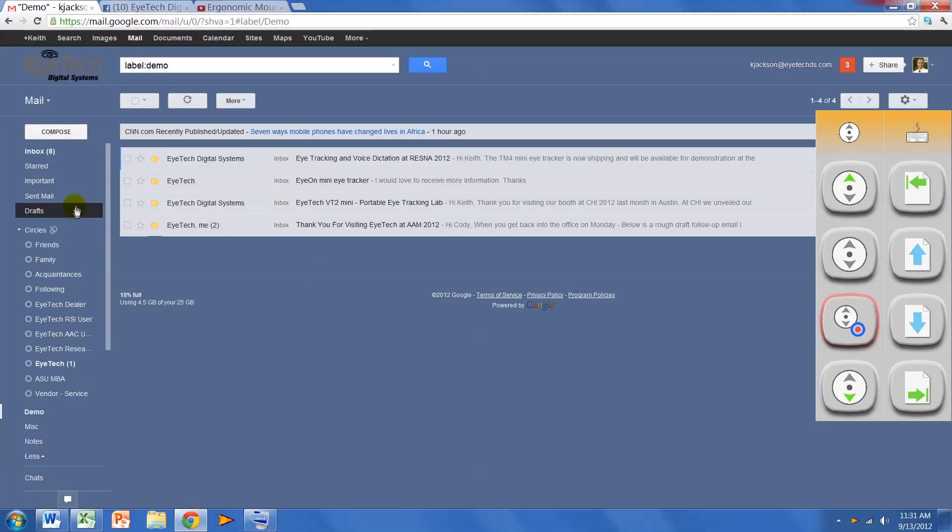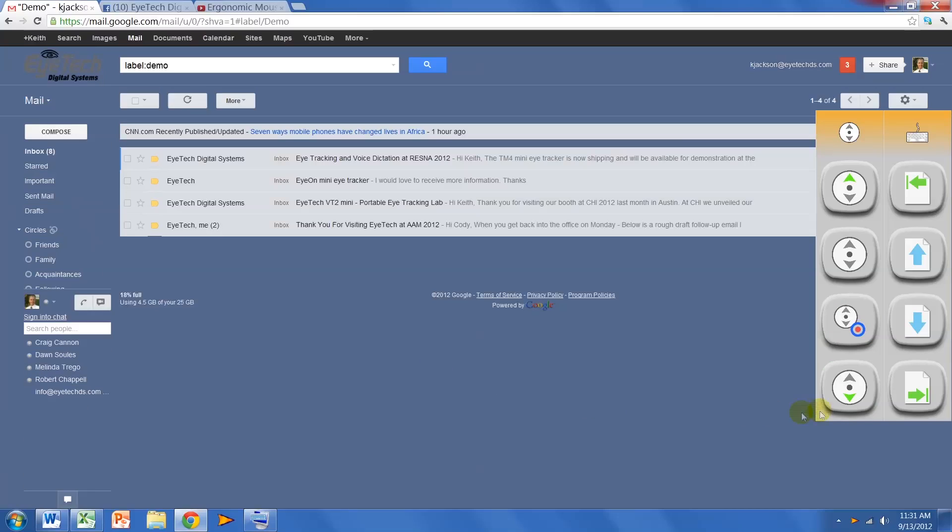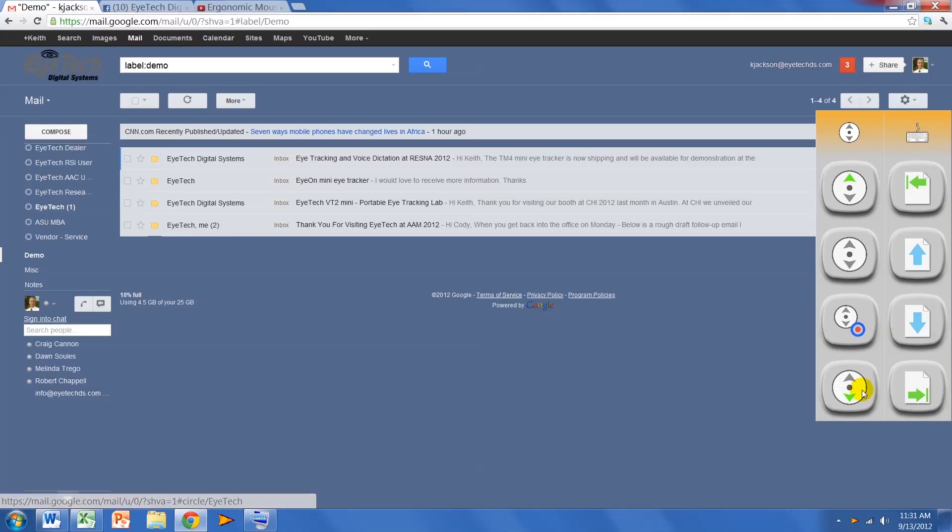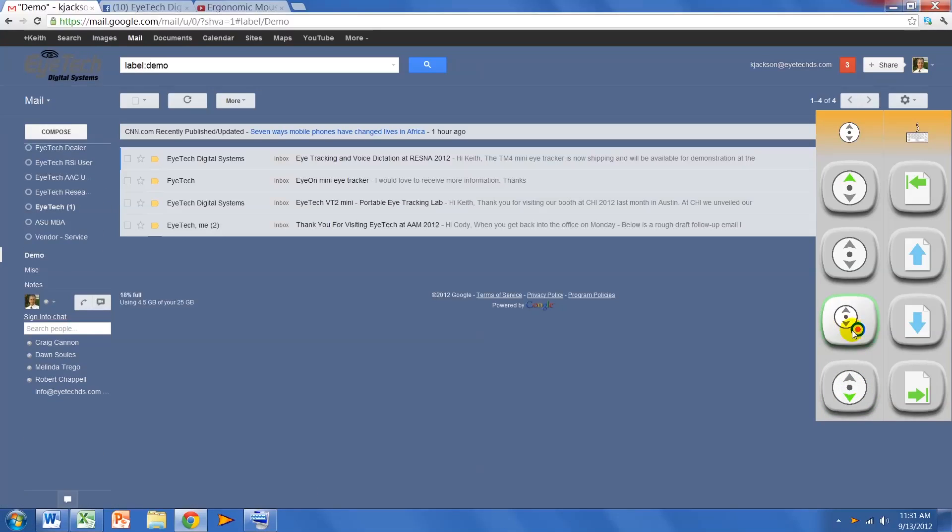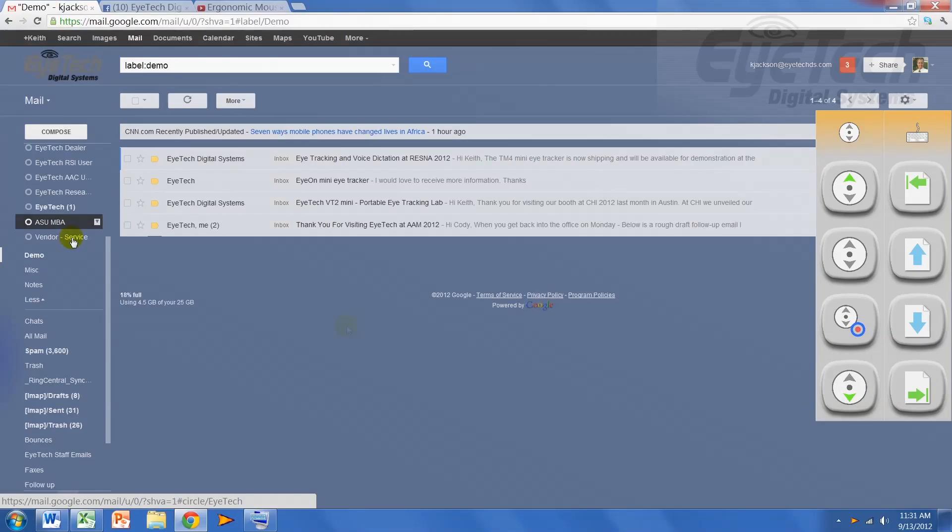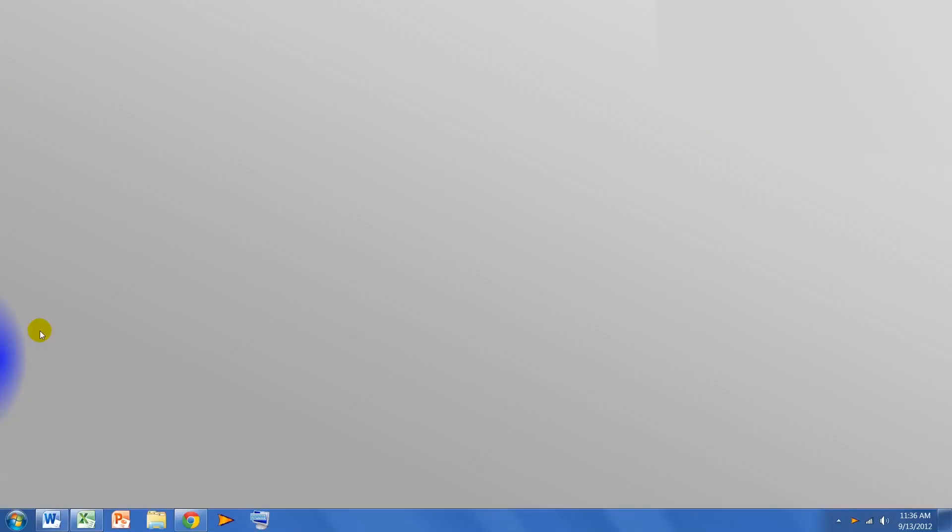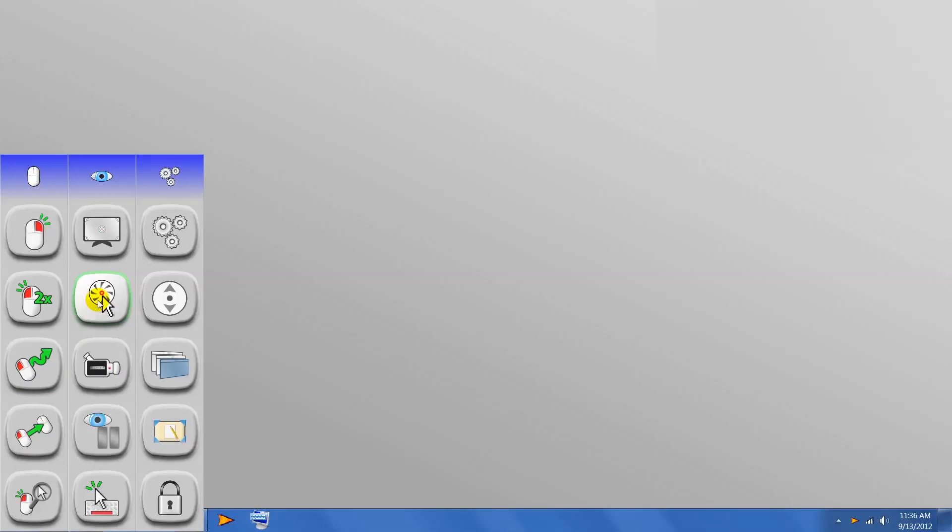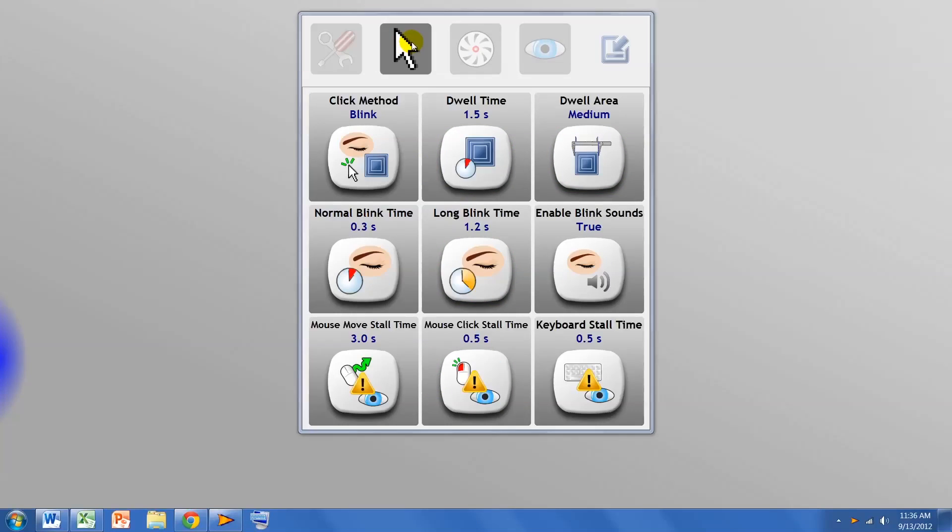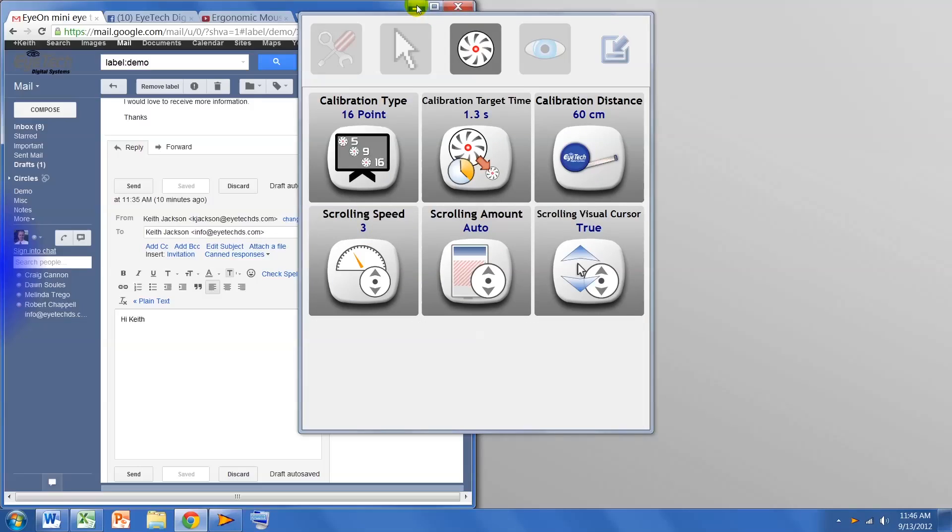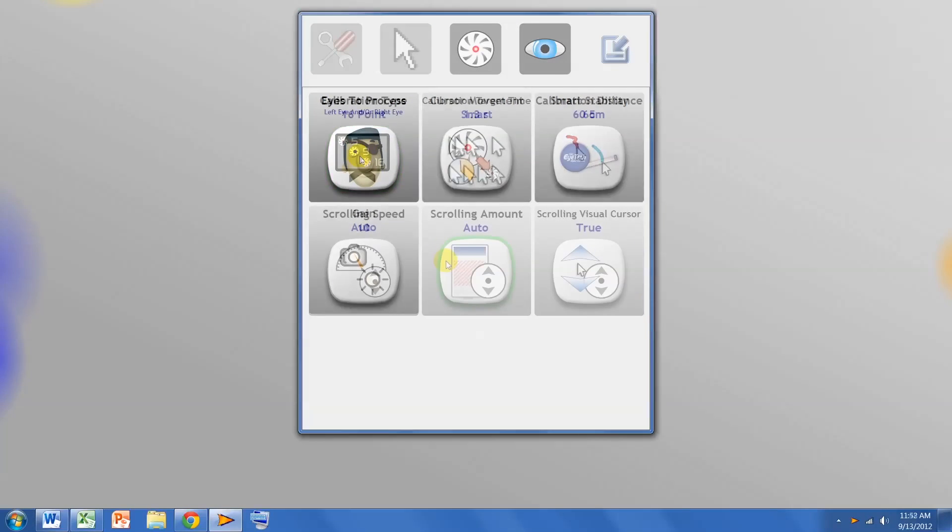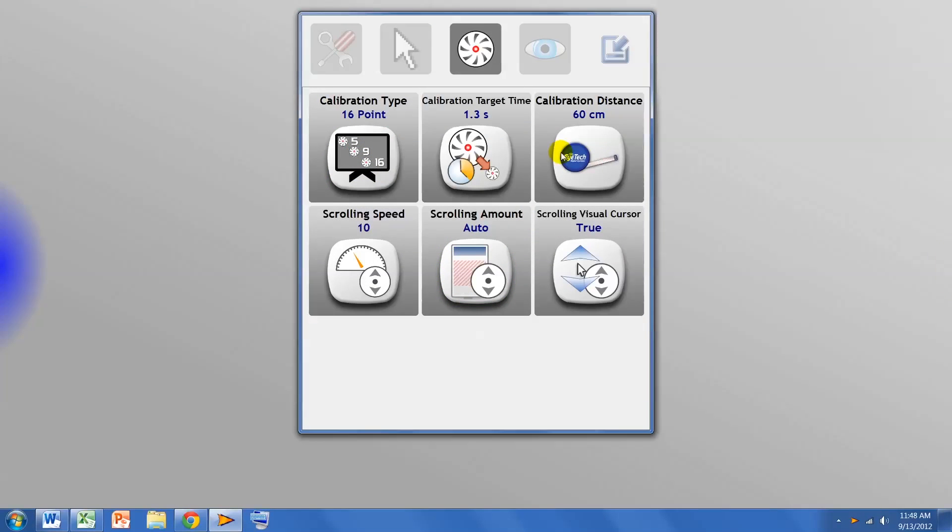For most users, the default settings should be ideal, but for users interested in adjusting any of your settings, just go to the blue hotspot and select the settings icon. Here you can adjust your toolbar, mouse, calibration, or eye tracker settings. When you're done, just click on the minimize icon.